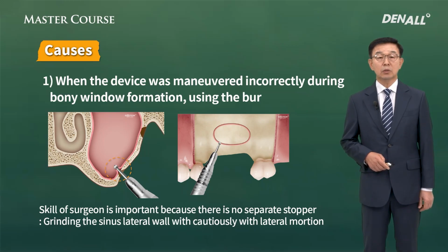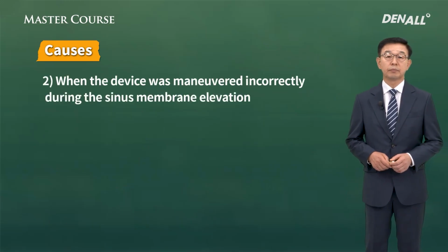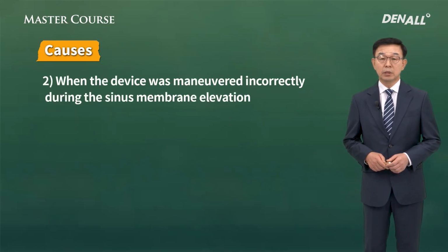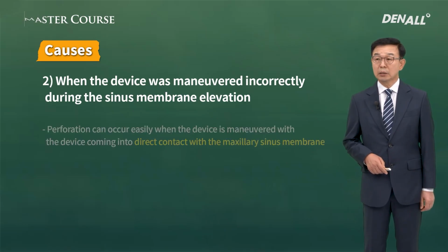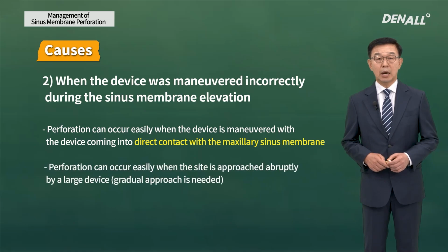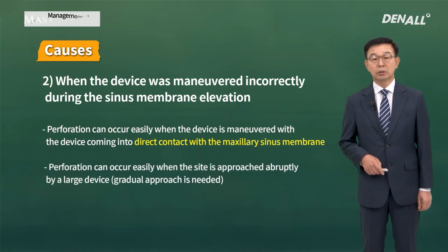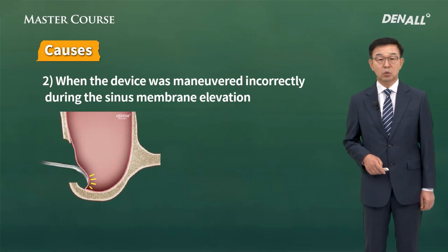Next, perforation can occur while sinus lift is done. When you use tools to do sinus lift, perforation can occur easily when it is in direct contact with the maxillary sinus membrane. And if you apply a big device, all of a sudden, perforation can also occur.